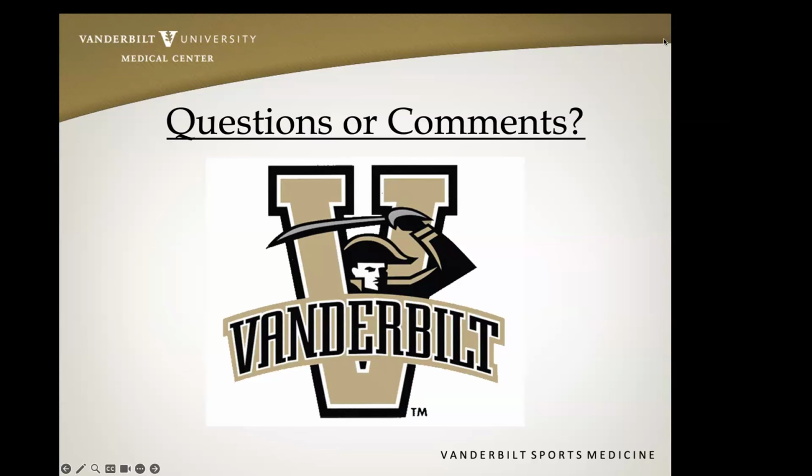So if you're highly suspicious for injury to the calf muscles, and you don't see anything in the gastroc, and your differential diagnosis screen is negative, that's someone you probably should think about getting an MRI on, because that's something that we miss really commonly on ultrasound.